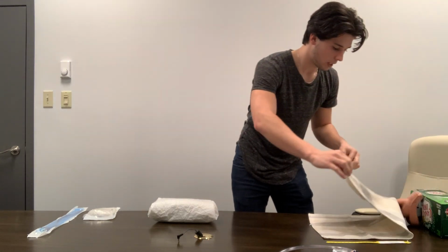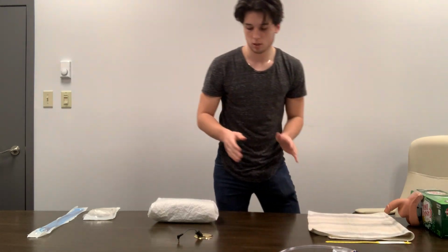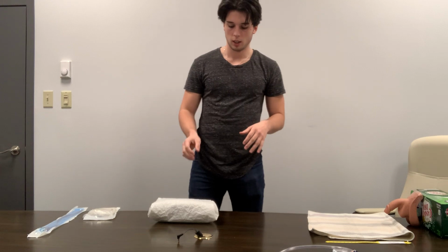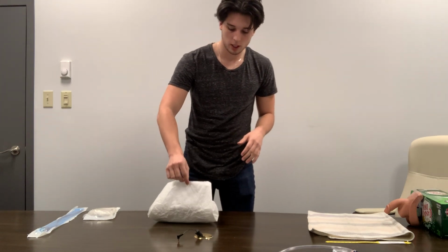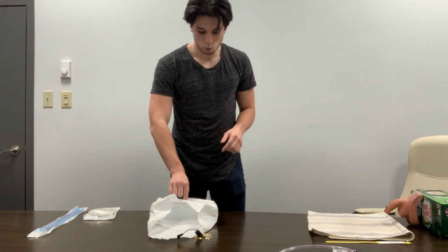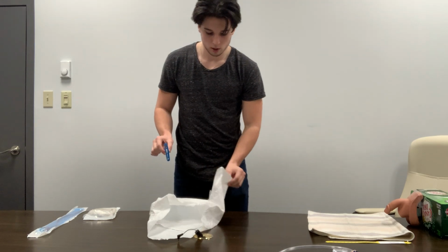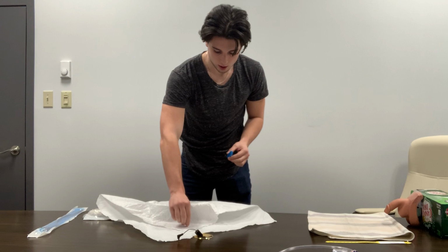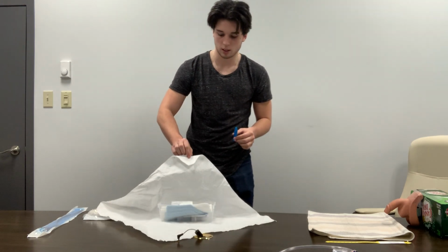So we're going to expose them here, and then we can start right away on our sterile field. Noting to maintain sterility of only grabbing in the 1-inch border of the sterile field, we're going to open it, not touching anywhere inside the 1-inch border.